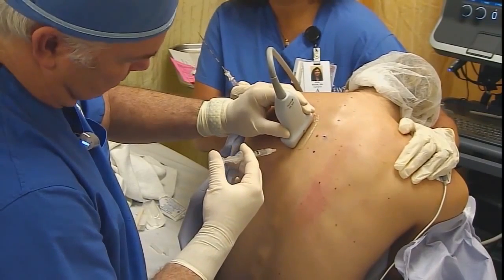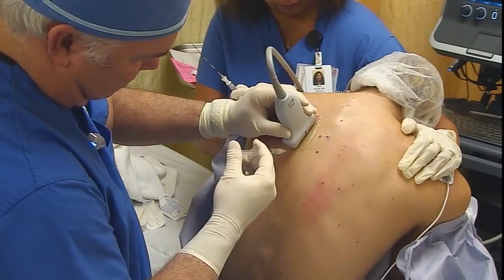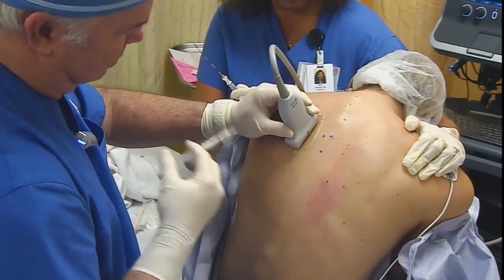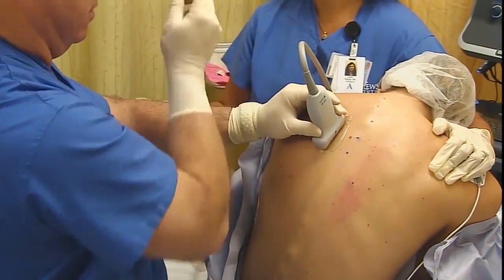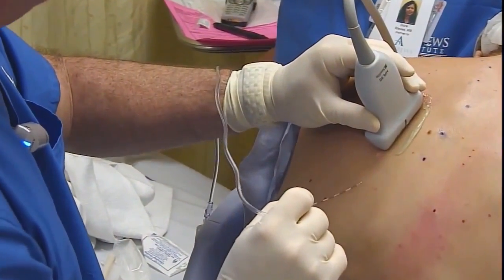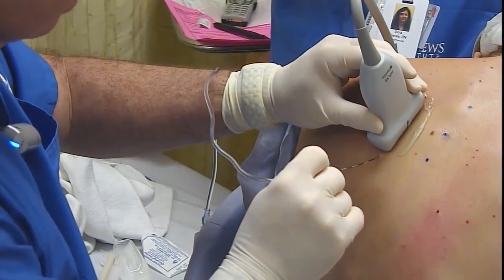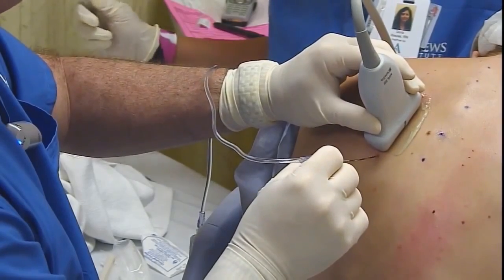One of the important factors is the injection port where you start your injection has to be very close to the probe to be able to get the tip of the needle between the two transverse processes. With this very steep angle, it's very difficult to see your needle. So echogenic properties are very important in your needle to be able to see it as it approaches the transverse processes and the pleura.